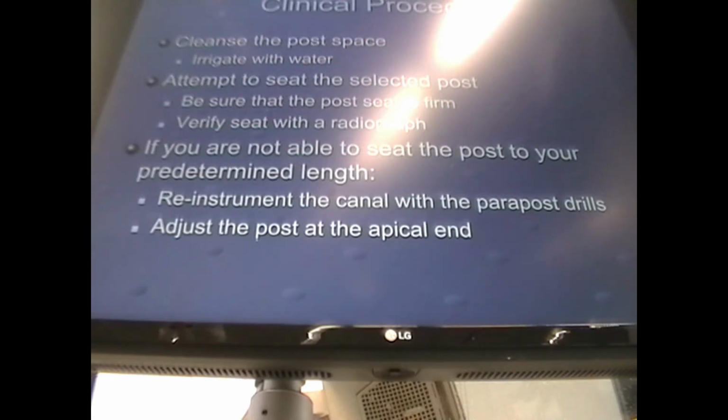They can deflect, and something you don't want to encounter with the patient is to push the post drill out labially or lingually and then hit the PDL. And clinically, generally the way you know that, if you've done a root canal on a tooth, you know there's no pulp tissue in it, and you push a post drill into a tooth and suddenly you see bright red blood, you've probably gone through the PDL and the tooth needs extracted. So root canal is wasted and the patient will be getting an implant or a fixed bridge. Okay?